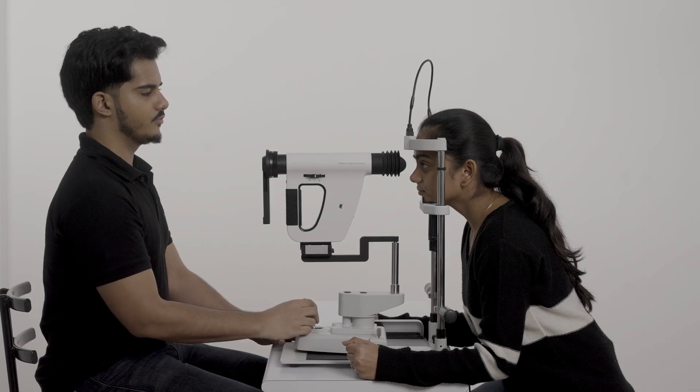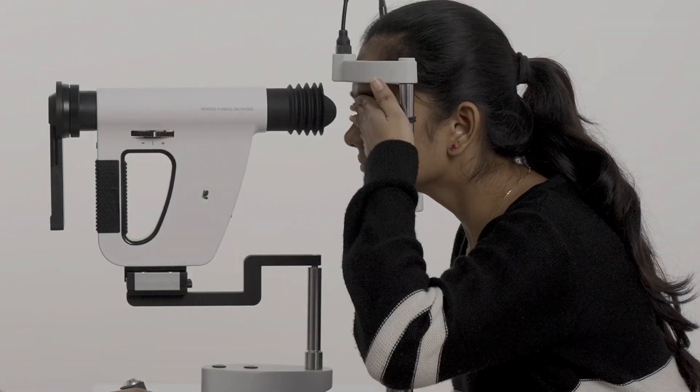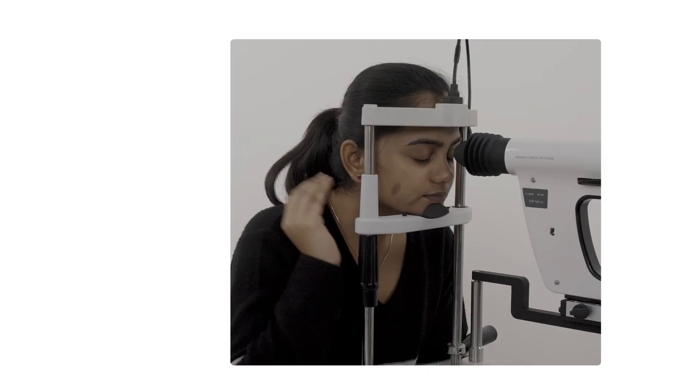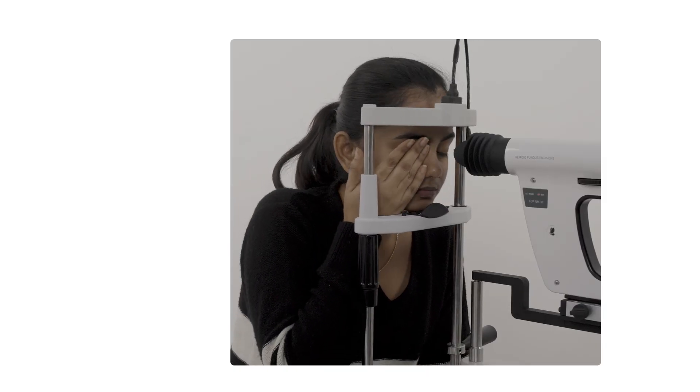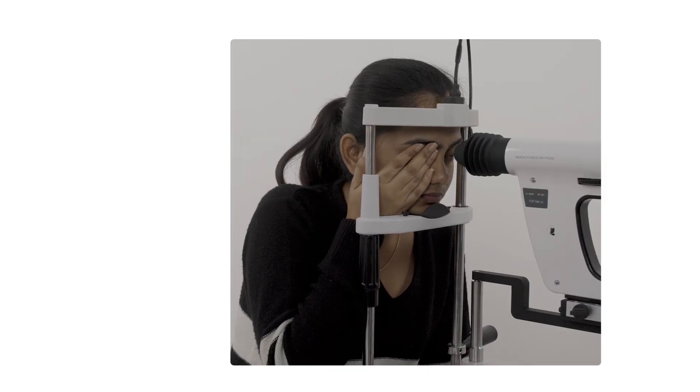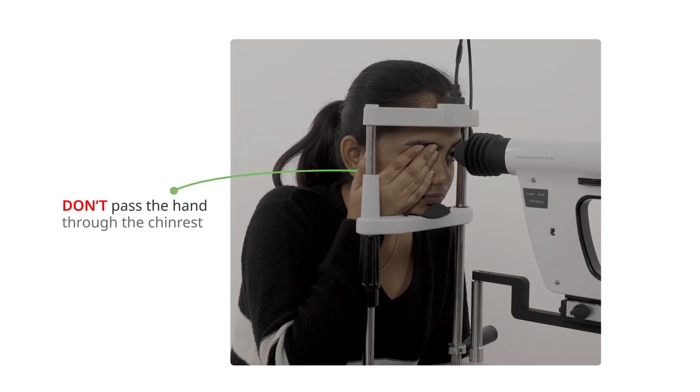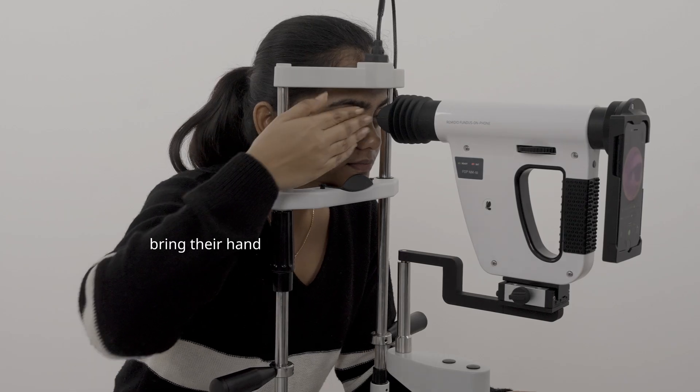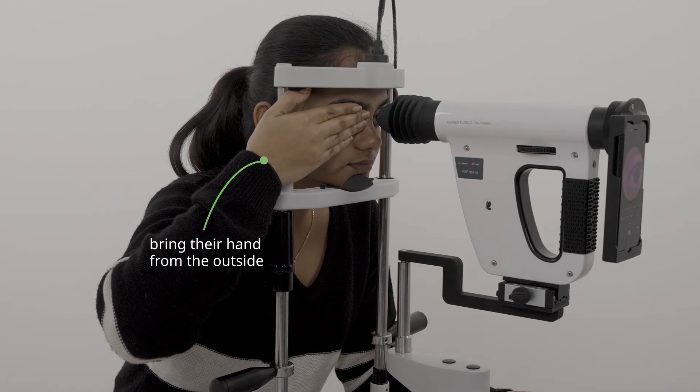Don't forget to ask them to close their other eye with a hand. The patient should not cover their eye by passing their hand through the inside of the chin rest. They should bring their hand from the outside of the chin rest and cover their eye.